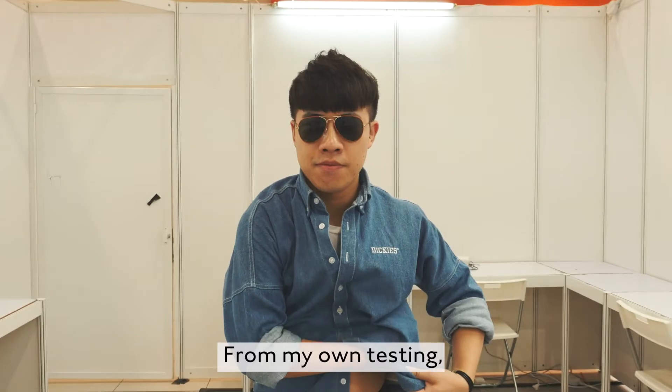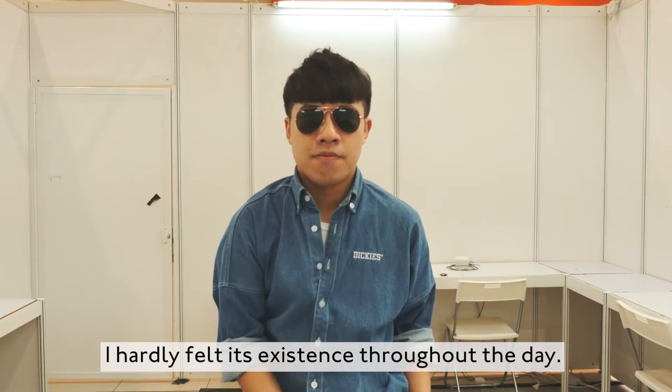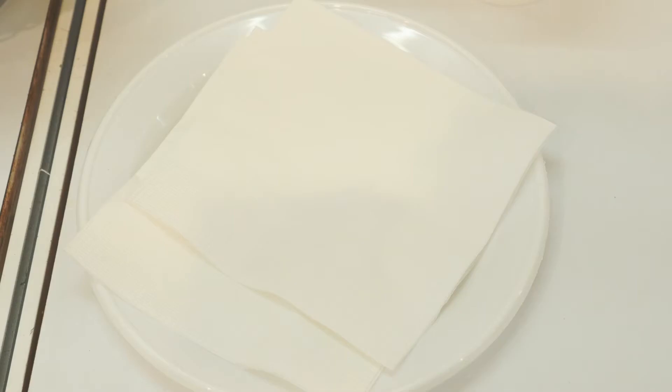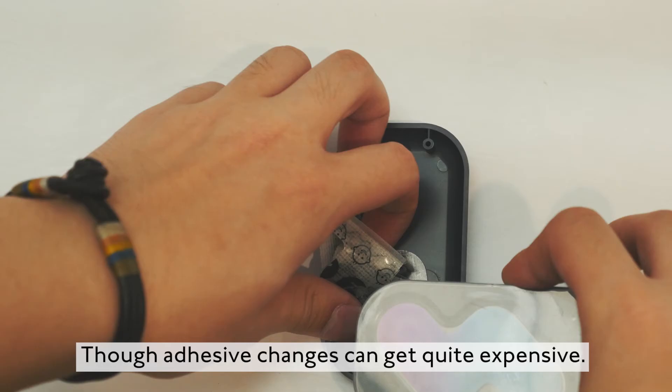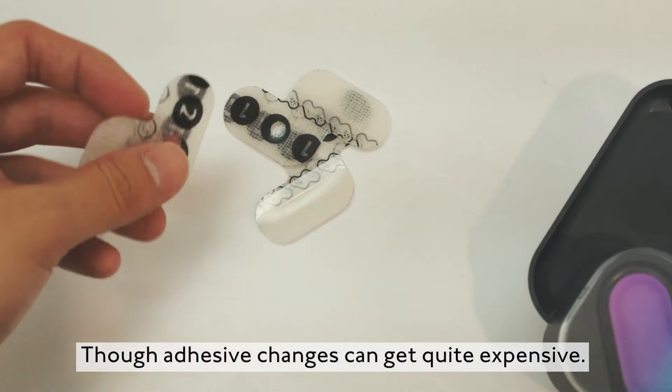From my own testing, I barely felt its existence throughout the day. But I should have changed the adhesive on the second day, though the adhesive replacements can get quite expensive.